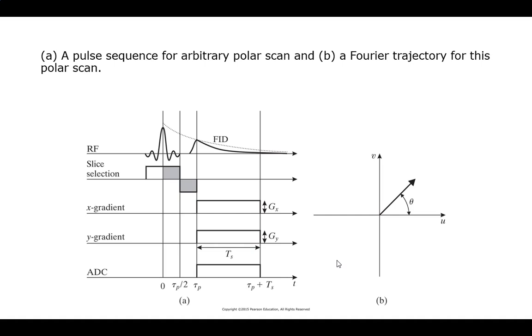We made up a sequence of events that are caused to encode frequencies, and we're just corresponding the frequencies to space, so you can decode them later on. It has a meaning to us.